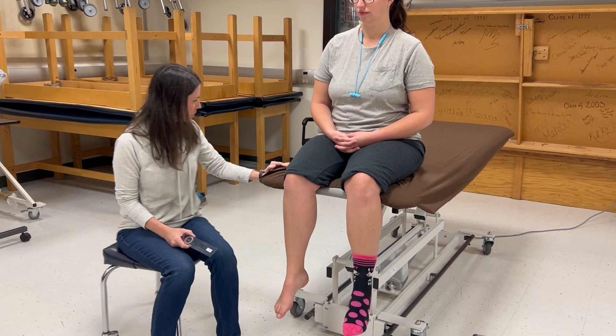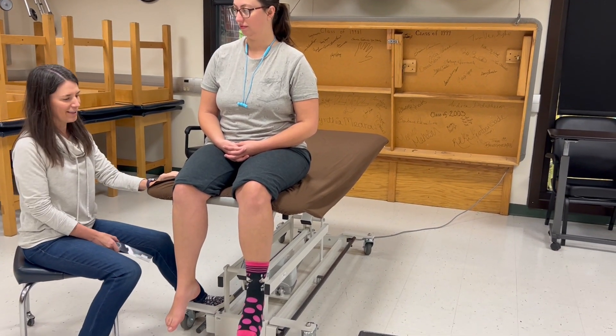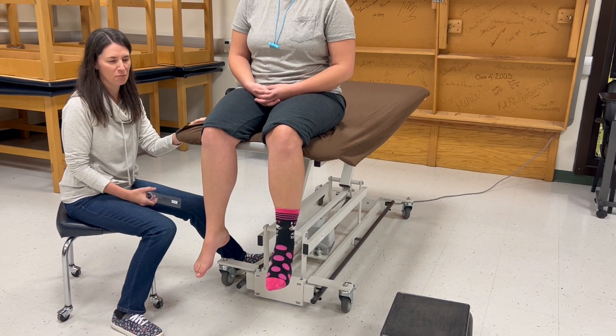The patient position is sitting on a table. We're using a high-low table so I can raise her up a little bit so that I don't have to bend over as much and have poor body mechanics.